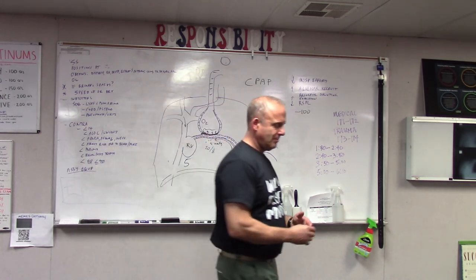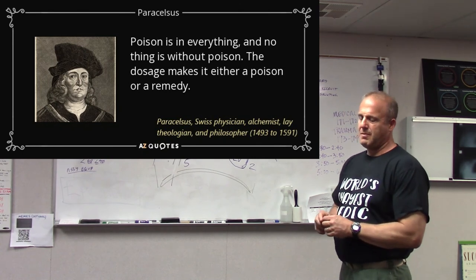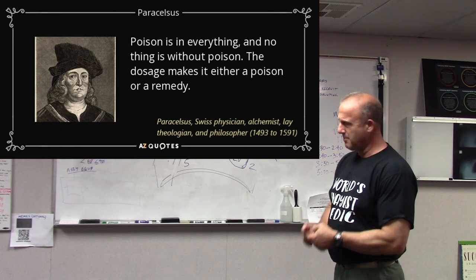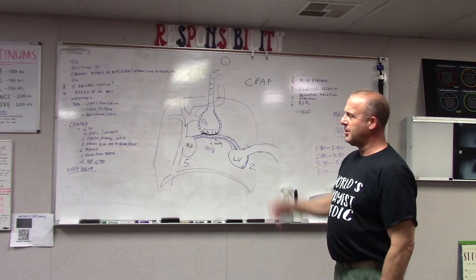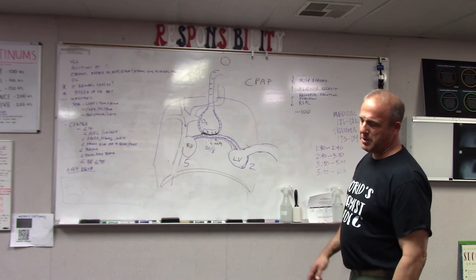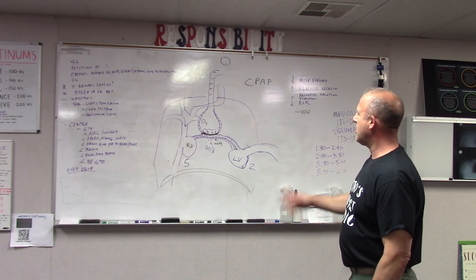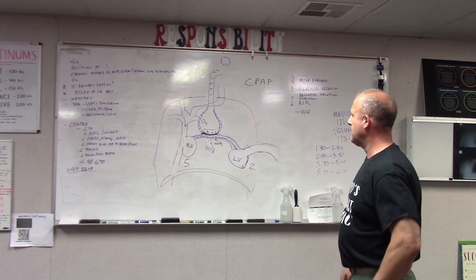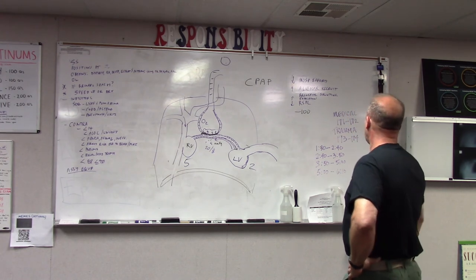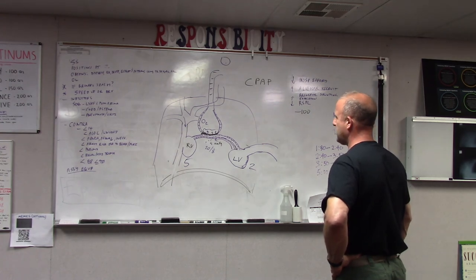I forget the name of the person who said it, but everything is toxic in the right dose, or if you take enough of anything, it'll be poisonous. Well, think of that. Too much intrathoracic pressure kills someone. Too little maybe hurts them, but in certain conditions, like left-sided failure, where you want to reduce preload, a little increase in intrathoracic pressure could be helpful. So I think for one, without a script, I covered most of the stuff.